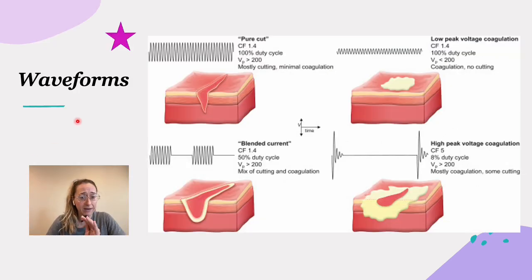Now let's get into waveforms. So this will be cut and coag here.